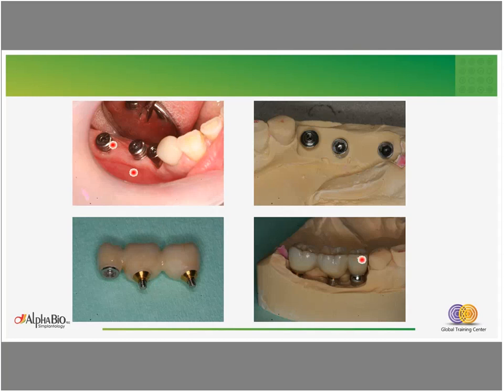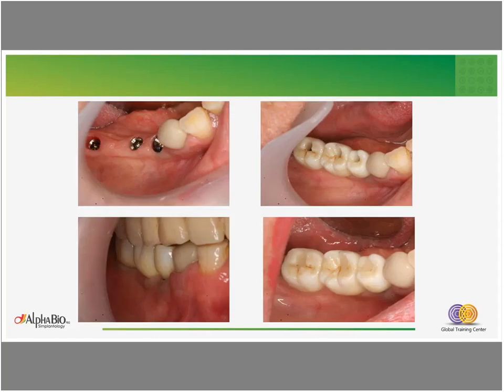This is the abutment level, and these are the implant level, and we can make the screw-retained restoration without any problem of the pathway of insertion. After the connection of the restoration, we can block these openings with composite, and this will be a very good result of the case.